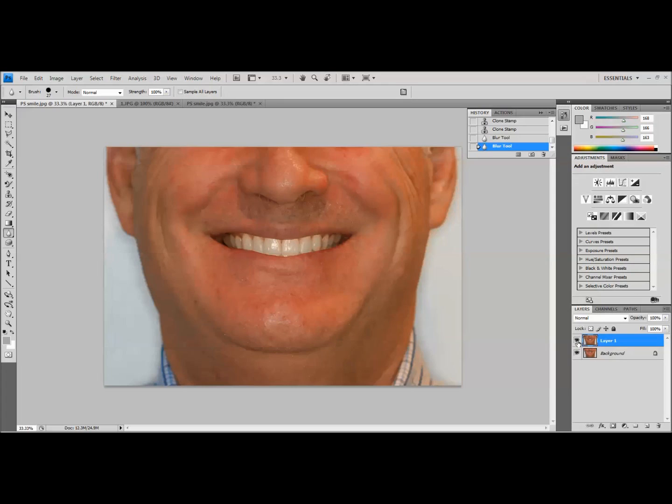And so we've got a very nice smile simulation, just took a few minutes to accomplish. And the more you do this, the quicker it gets, it really can be done in about five minutes if you've got a good library of teeth to put in and have just done the process enough that you're comfortable moving through the software. So I hope that was helpful. Hopefully we'll have more videos coming out soon.